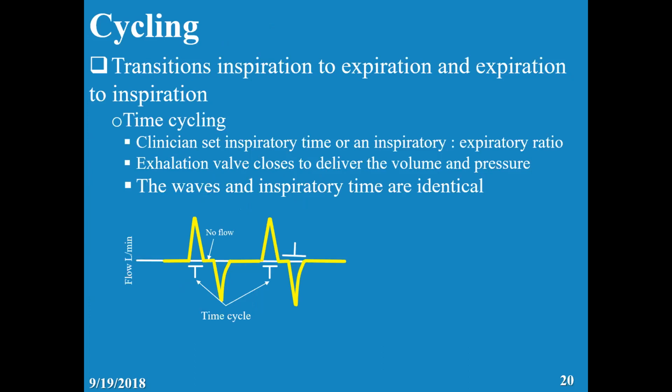What is cycling? If you remember, cycling is the transition of inspiration to expiration and then expiration to inspiration. So inspiration, expiration, expiration, inspiration. The cycling can be time.